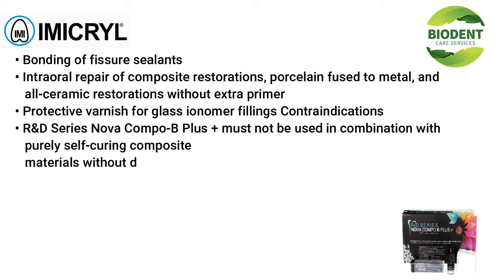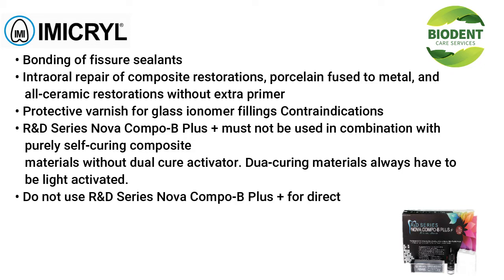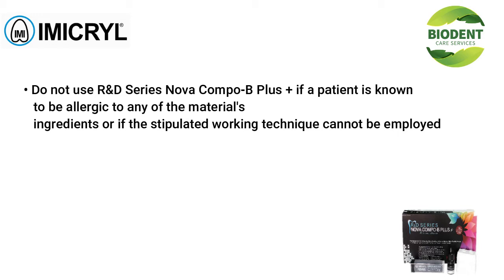Contraindications: R&D Series Nova Compo B Plus must not be used in combination with purely self-curing composite materials without dual cure activator. Dual curing materials always have to be light activated. Do not use it for direct pulp capping. Do not use it if a patient is known to be allergic to any of the materials or ingredients, or if the stipulated working technique cannot be employed.